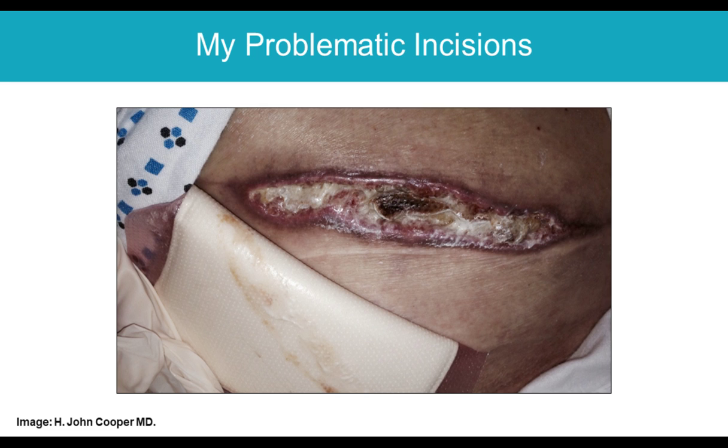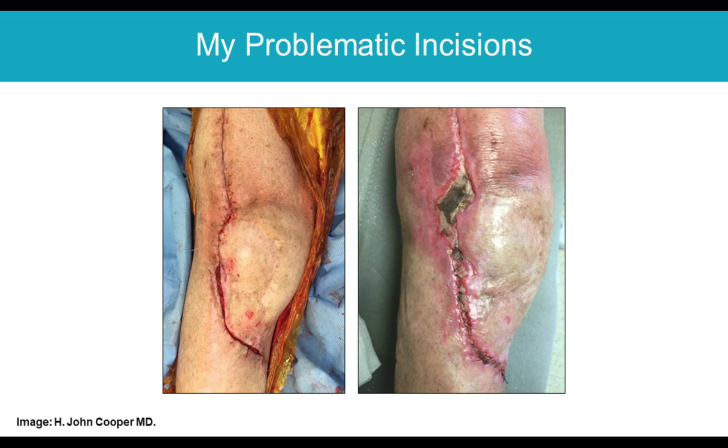This is another wound he has since in a very ill, obese patient undergoing a complex revision surgery with very poor wound healing. And I'll end on this one. Unfortunately, I have many more pictures like that to show in my high-risk patients, but I'll end on this one because this is the case that, in my practice, caused me to change the way I approach these high-risk patients.